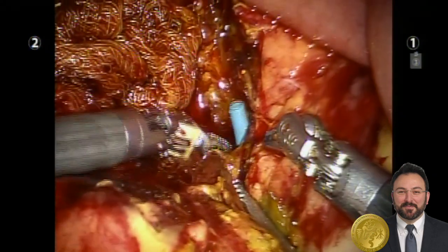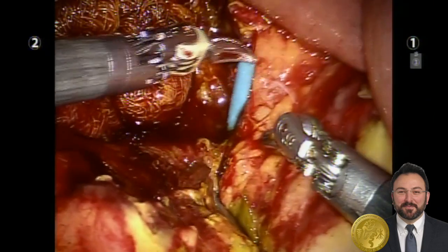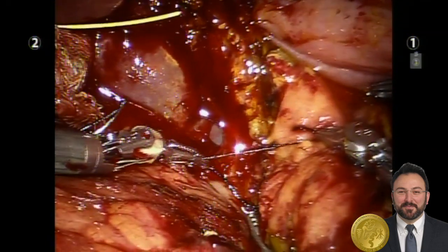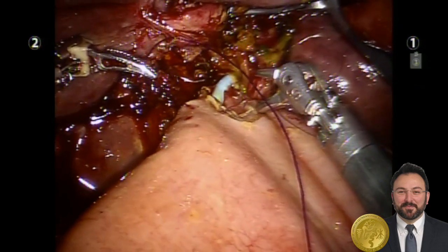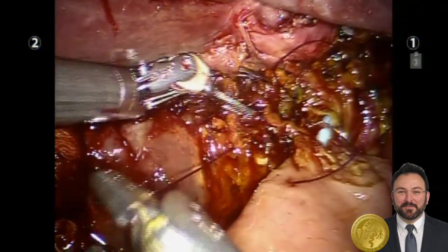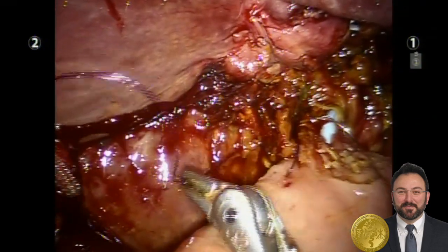The common bile duct, which had the ERCP stent in it, was closed so that stump could no longer leak. The pigtail in the left biliary system was advanced into the hepaticojejunostomy, and the posterior row was completed.